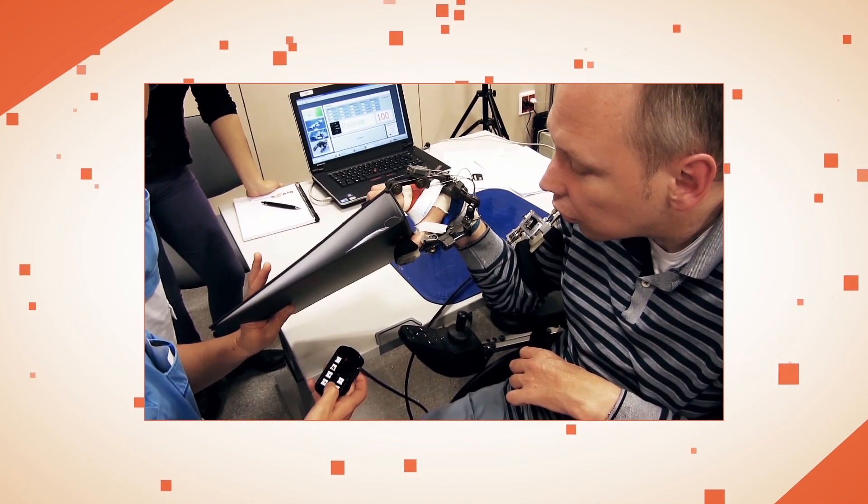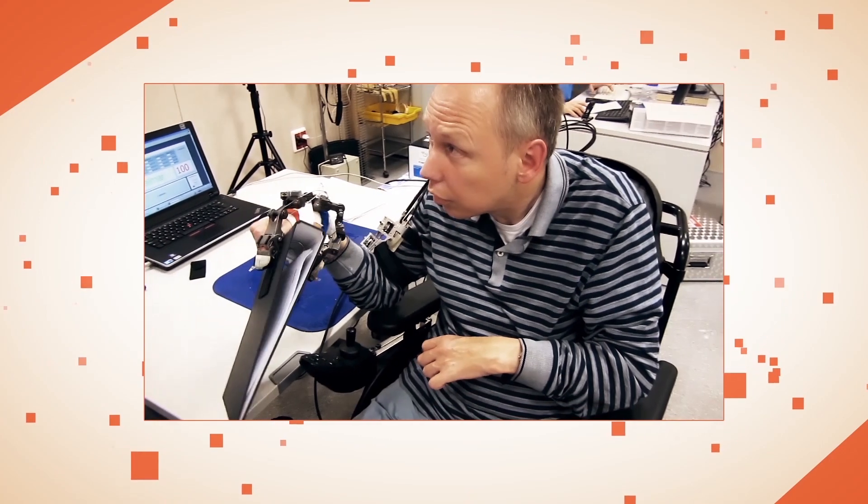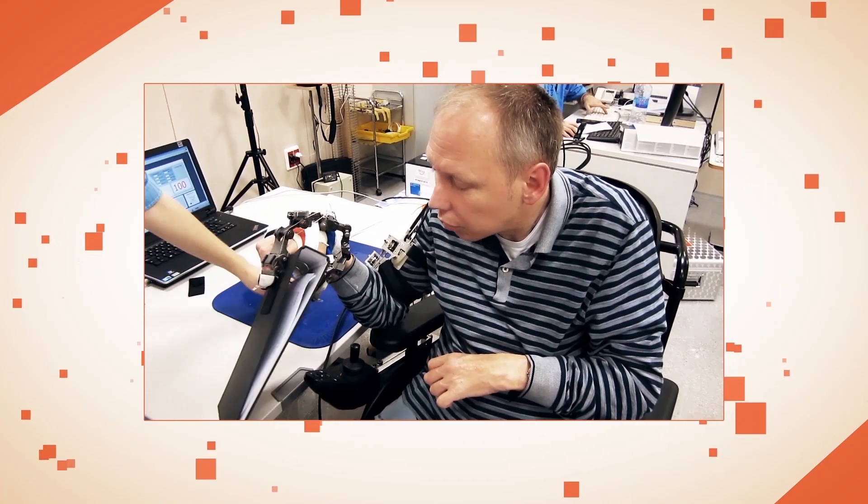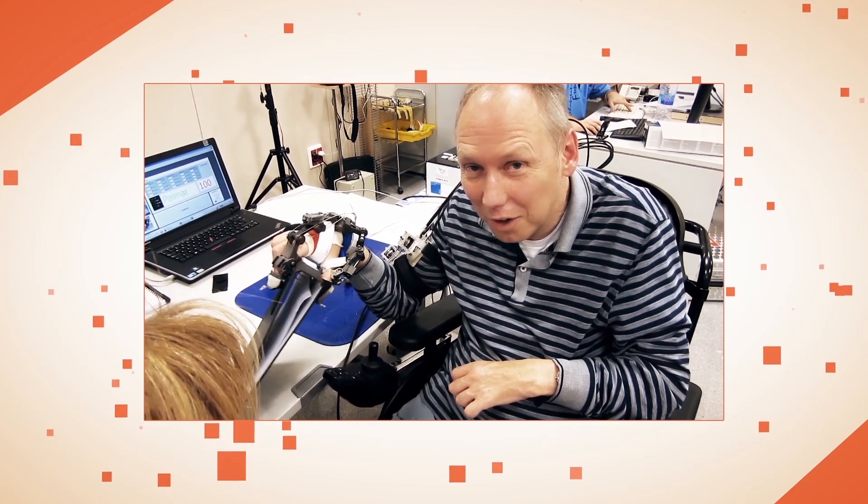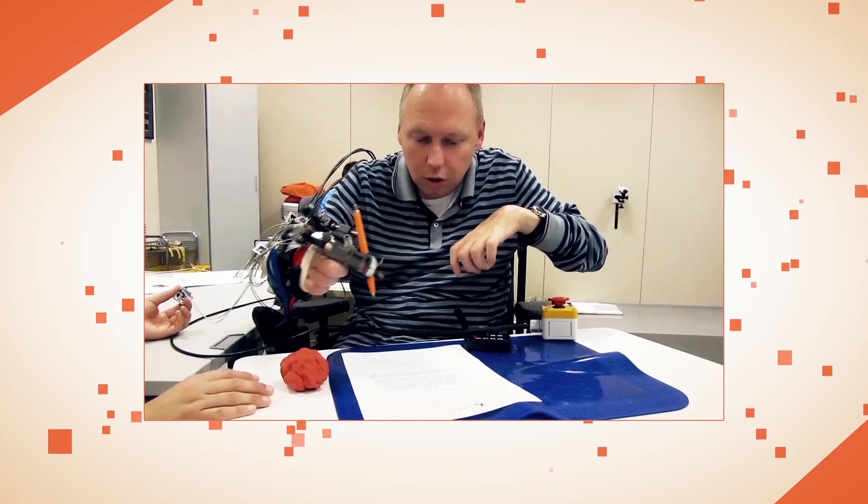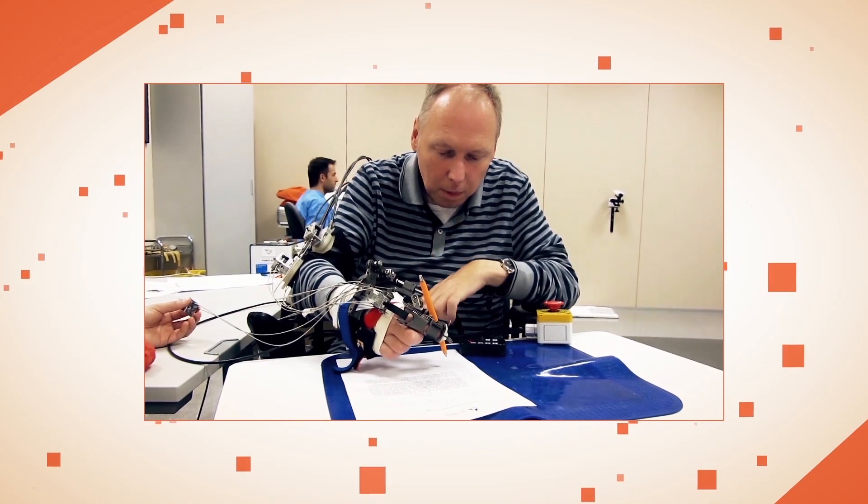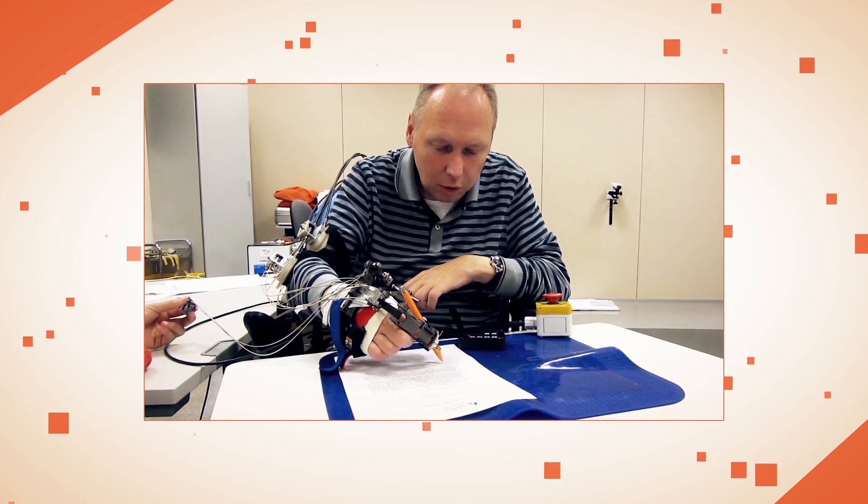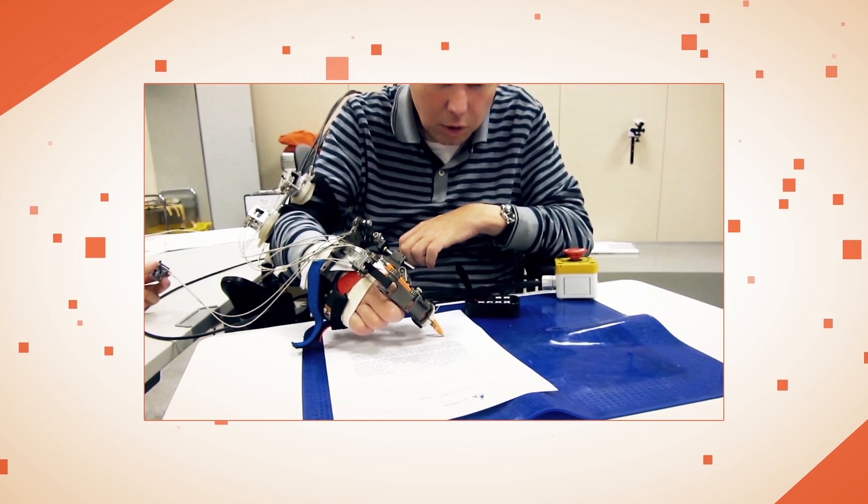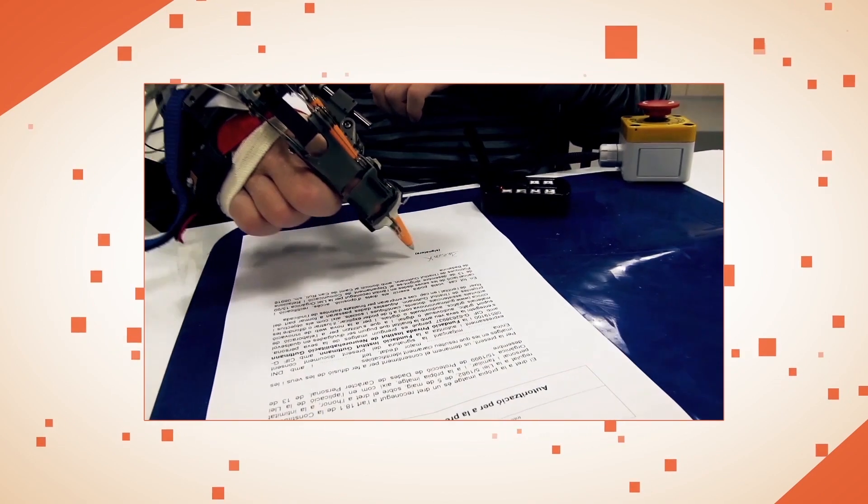The hand exoskeleton developed by engineers at the Scuola Sant'Anna could support and assist his movements due to miniaturized motors and self-aligning mechanisms. Frank is wearing the thumb-index exoskeleton and is controlling three different grasps by a remote control. The whole system is fitted on a wheelchair at the Guttmann Institute in Barcelona and is powered by a battery.